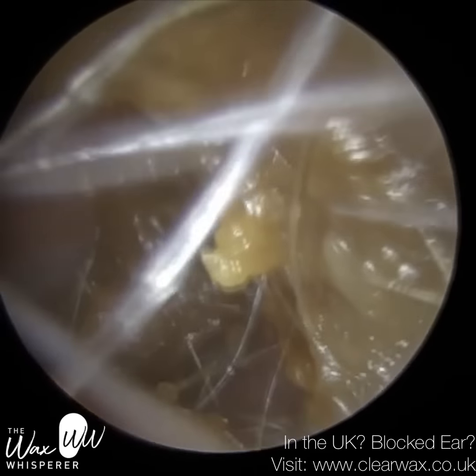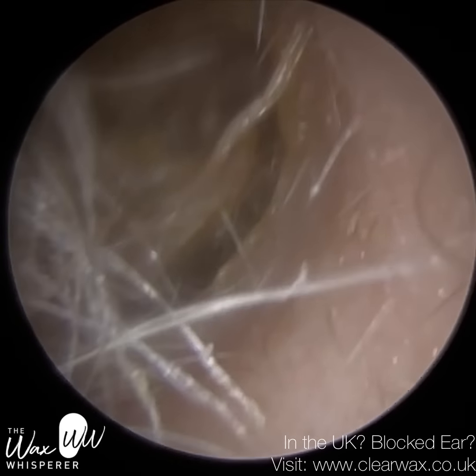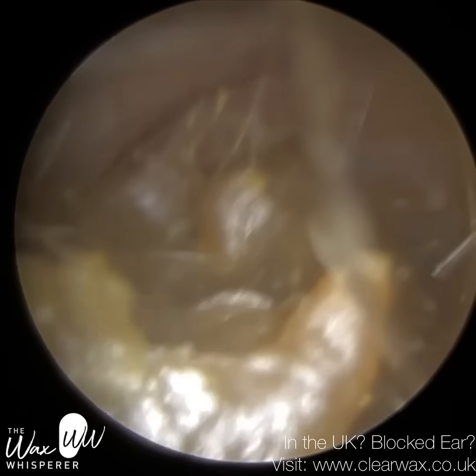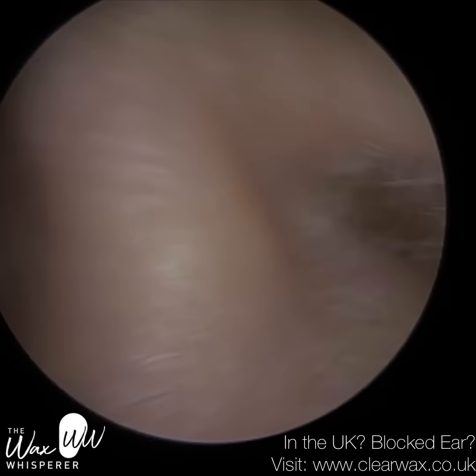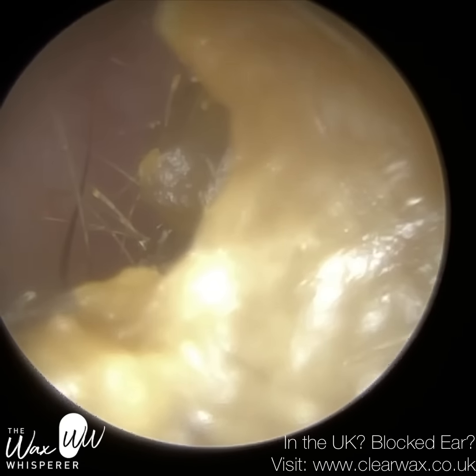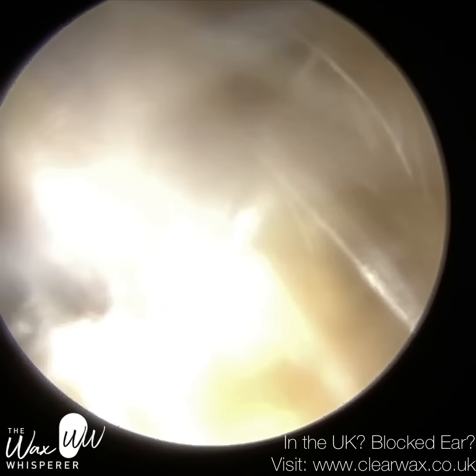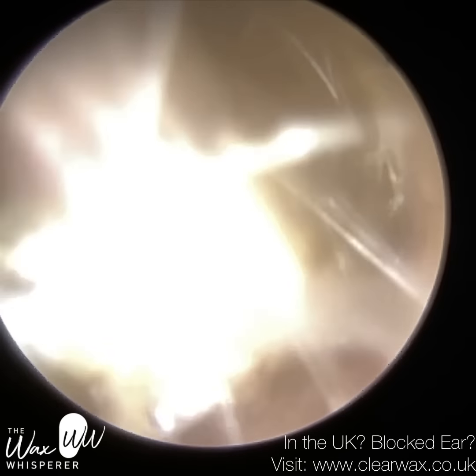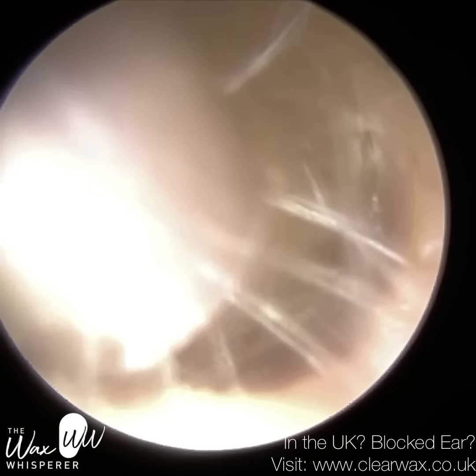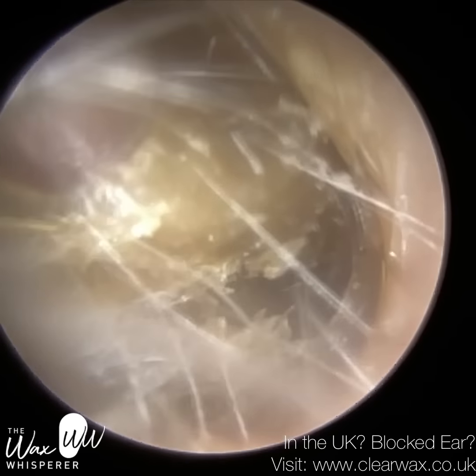So this is patient 2. This is their left ear. Again, they have got quite long hair strands at the entrance, which can sometimes smear the lens of the endoscope, even because we're trying to get this through without making contact with the hairs, but there's so many, they are going to, unfortunately, come in contact. And when you're quite close to the hairs, you do get a reflection, as you can see there. Also, the reason why this is reflecting is this patient's got a lot of dead keratin, a lot of dead skin in this wax plug.